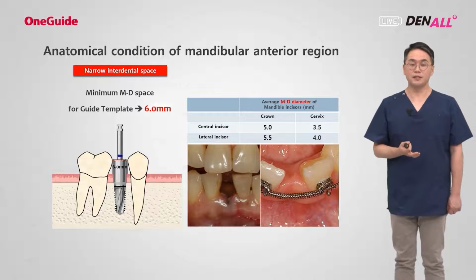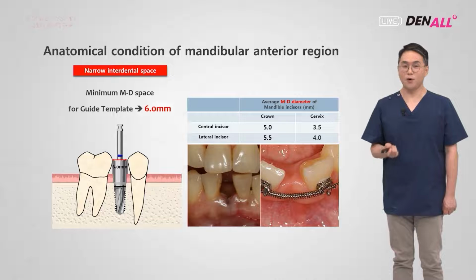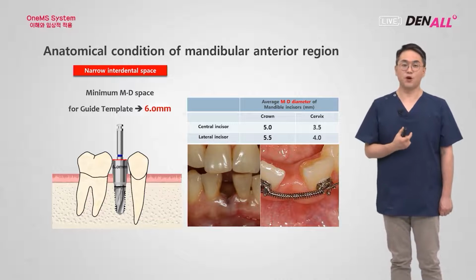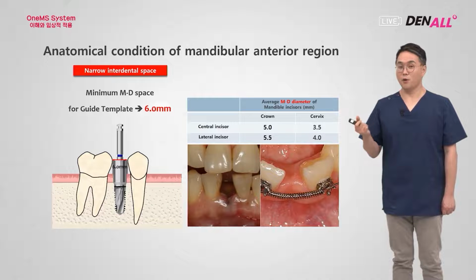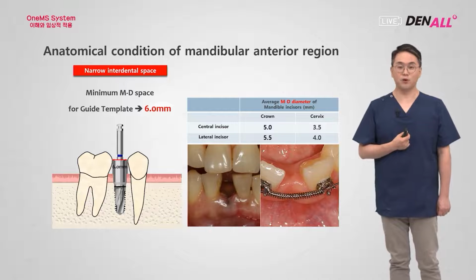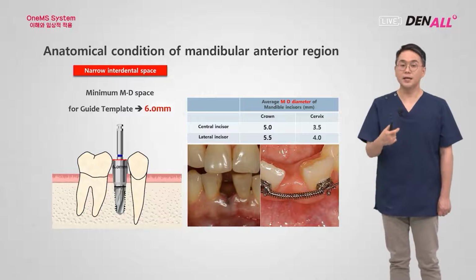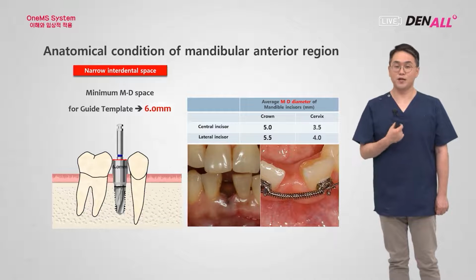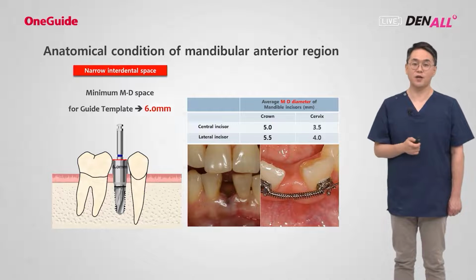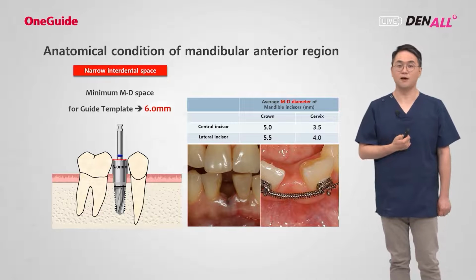Then, you might think using the OneGuide kit is possible, but if you look at the OneGuide kit, the OneGuide drill stopper diameter is 6.0. But as you can see in the photo, if the mesial-distal distance is less than 6, what to do? You cannot use the OneGuide kit because for the OneGuide drill to drill in full depth, the mesial-distal distance needs to be at least 6.0. But in a single missing tooth, that would not be possible. What to do?